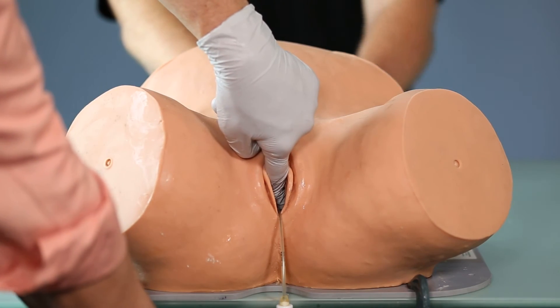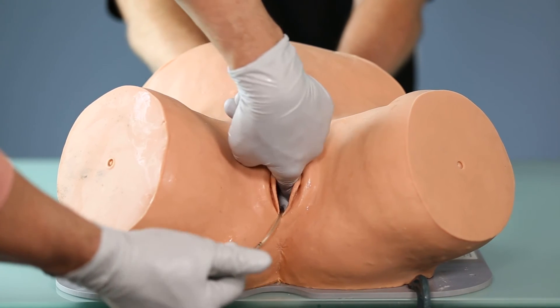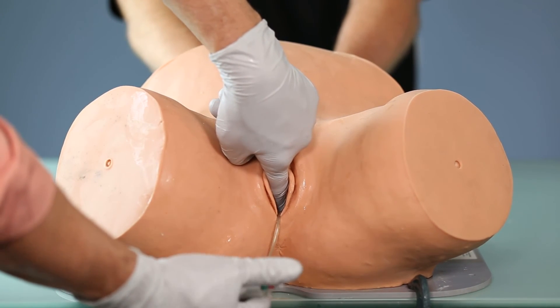Step number four is to establish vacuum and also exclude any maternal tissue that may be trapped underneath the cup as vacuum is applied.